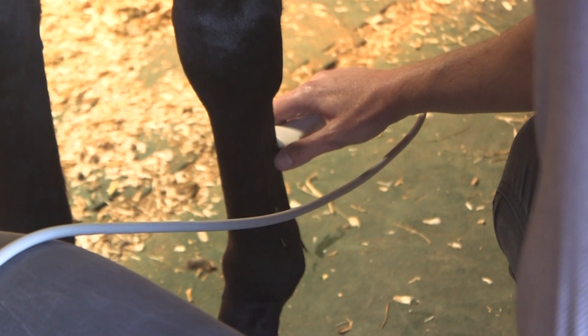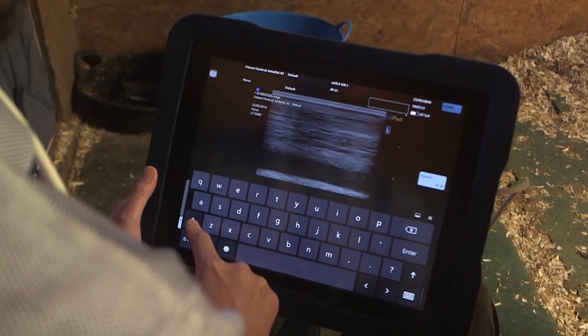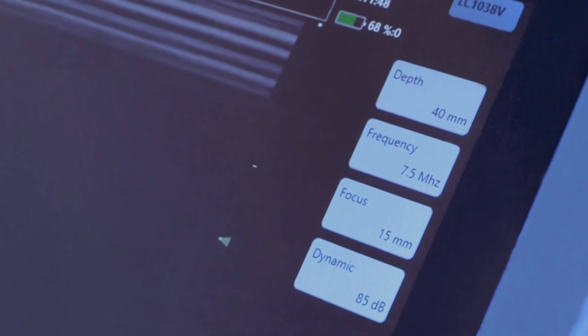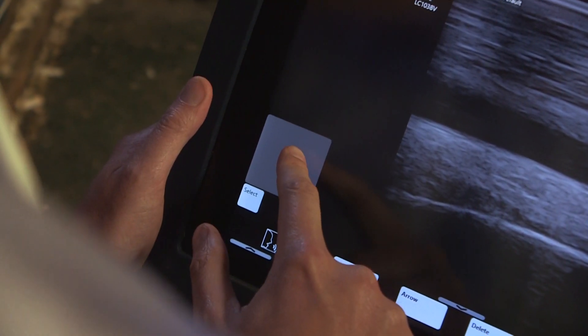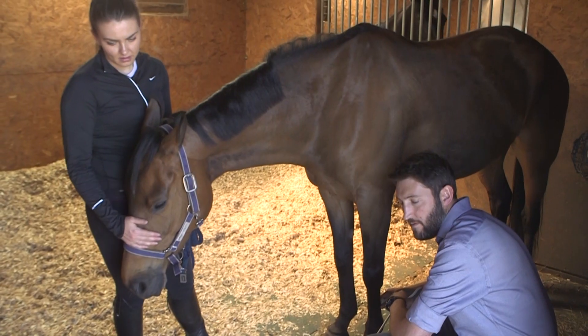The streamlined interface with touchscreen allows for quick annotations and the ability to detail specific measurements on the image. Only necessary functions are displayed on the screen, including a virtual trackpad, keeping the active imaging area clear and aiding an efficient user experience.